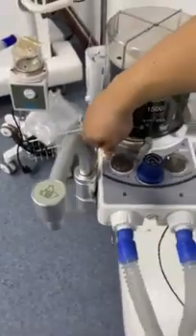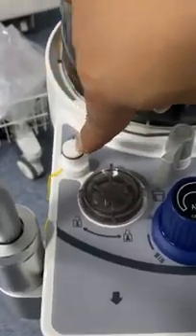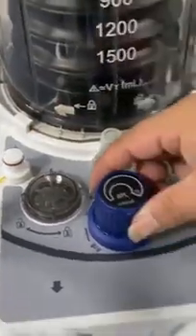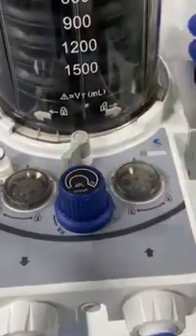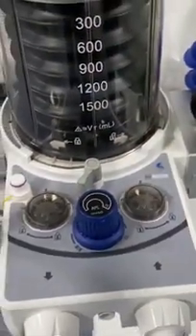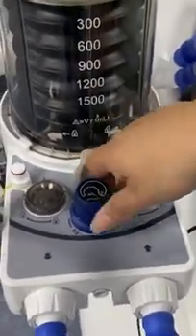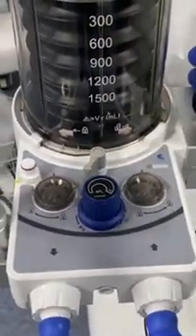Here, this port. Once we take this out, we can connect the oxygen sensor, so it can monitor the oxygen concentration. And this one is the APL valve. After the operation, if there is still gas and pressure inside the pipeline, then we can retrieve the APL valve to release the gas, and then the machine can be at rest.